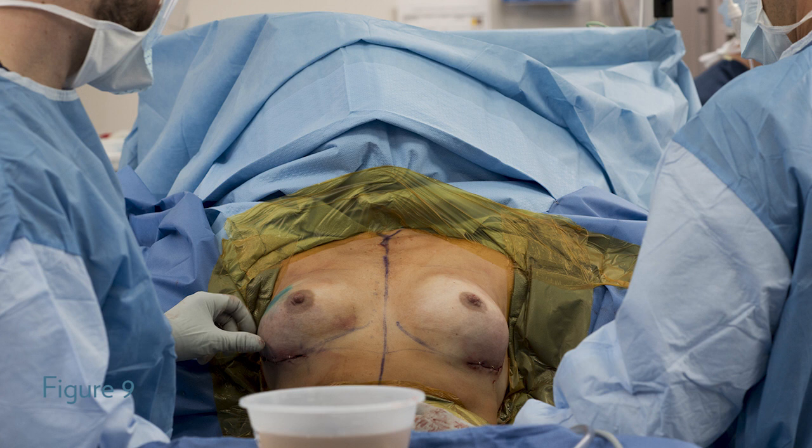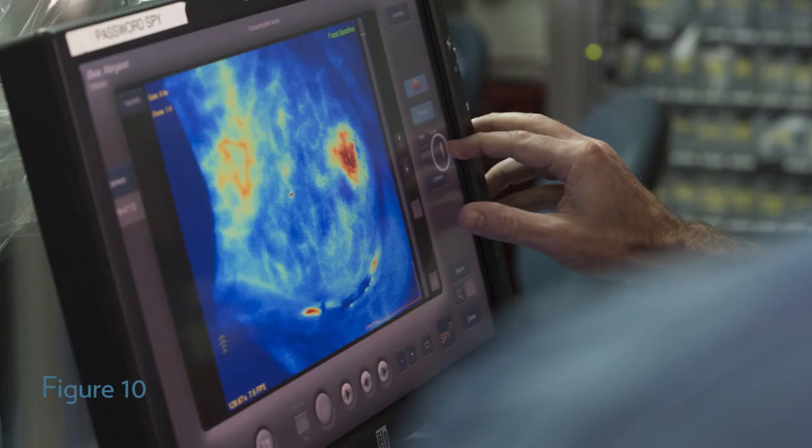In figure nine, sizers are placed in the breast pocket. The patient is sat upright. The sizers are bathed in triple antibiotic solution. The saline inflatable one-time use sizers can be used or the silicone gel sizers. In figure ten, a short-term perfusion angiography is done to evaluate the blood supply of the skin flaps while the sizer is in place.